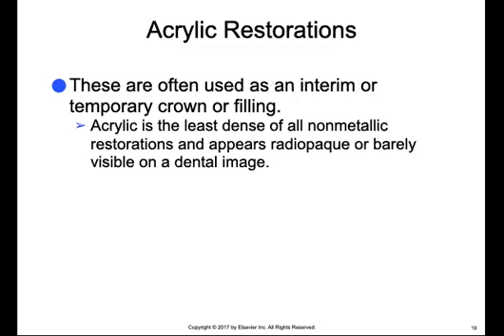Acrylic resin restorations are often used as a temporary crown or filling, and of all the non-metallic restorations, acrylic is the least dense and appears slightly radiopaque on a dental image.